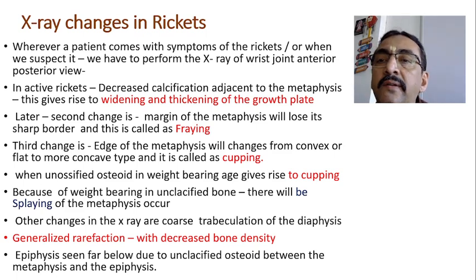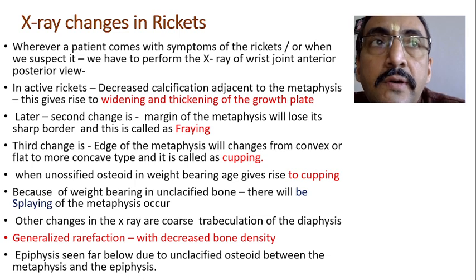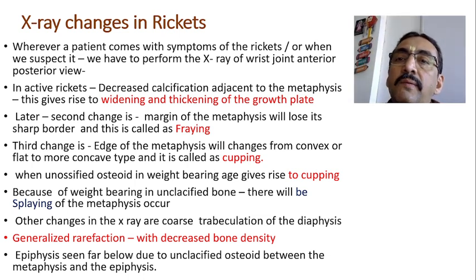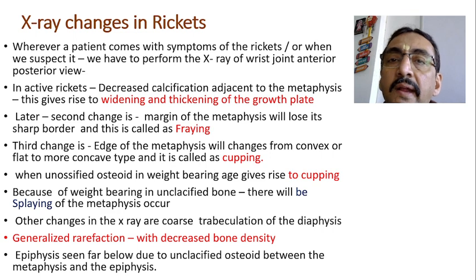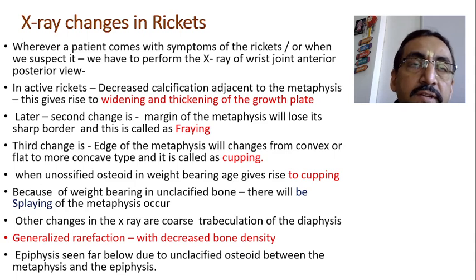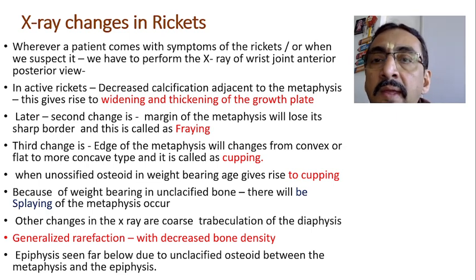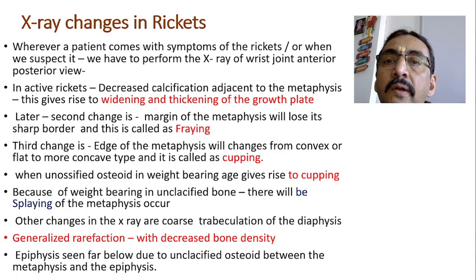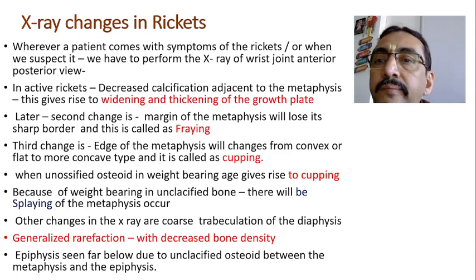And my dear friends, as we know, we are all discussing rickets. In rickets, today we will understand some of the important facts regarding X-ray findings in rickets. Because X-ray is the first investigation that we will advise whenever we have any suspicion about rickets, isn't it? So we should know some of the important X-ray findings of rickets, especially in children.